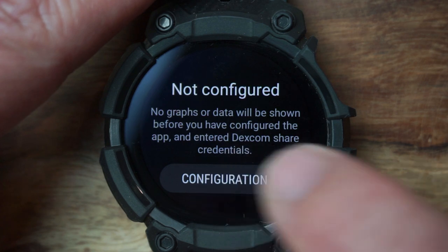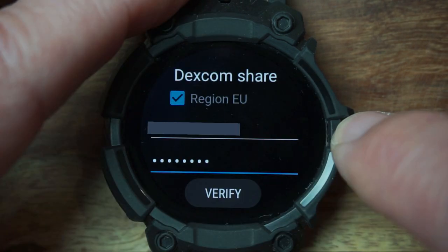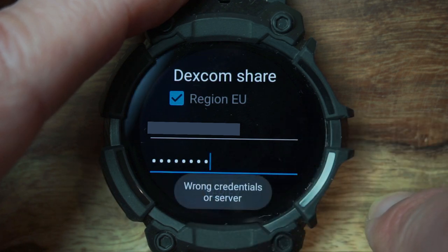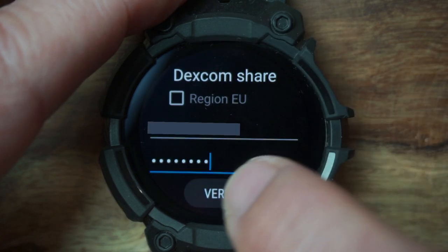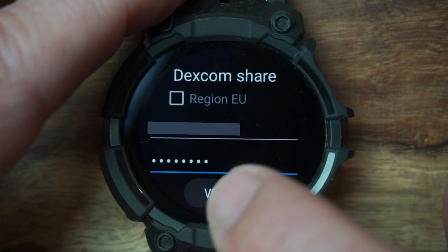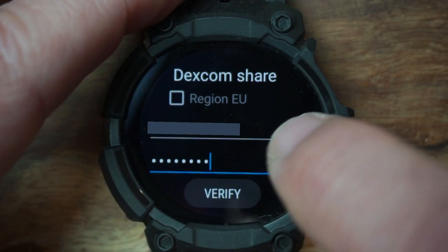It says 'not configured' — let's go ahead and configure it. Use the username and password from your Dexcom Share. It was giving me problems with a 'wrong credentials' error, but I was actually in the wrong region. Once I fixed that, it went through smoothly. After verifying, I realized there's also an option to scroll down for more settings.